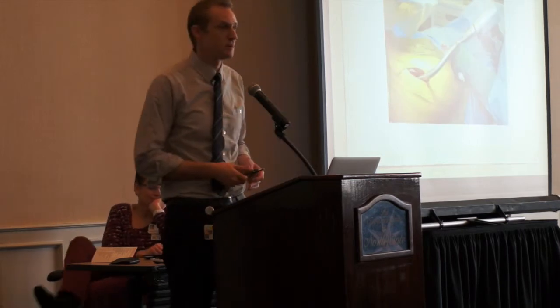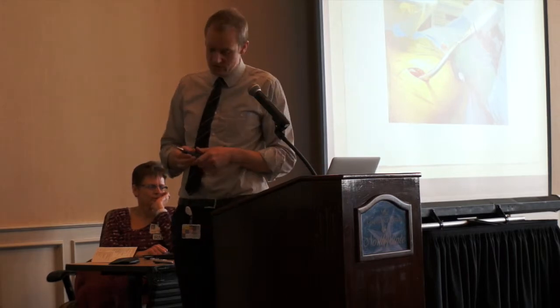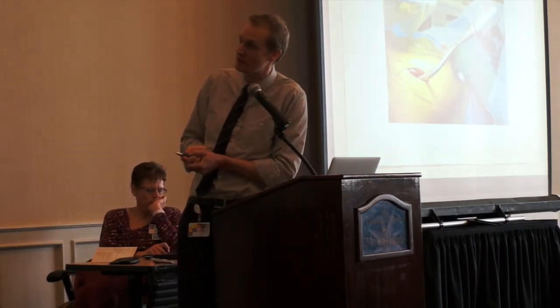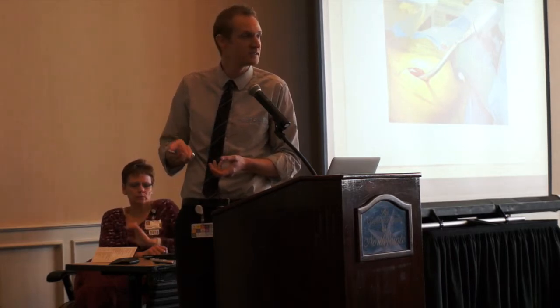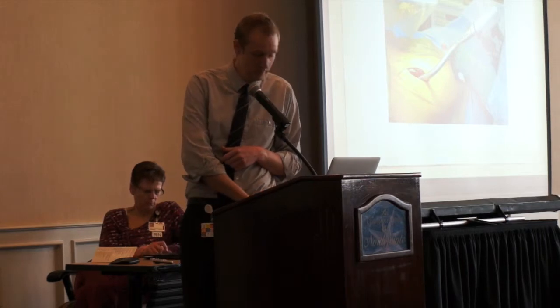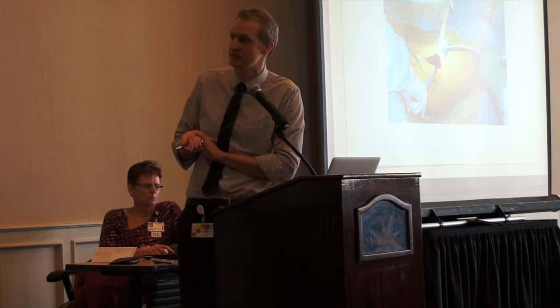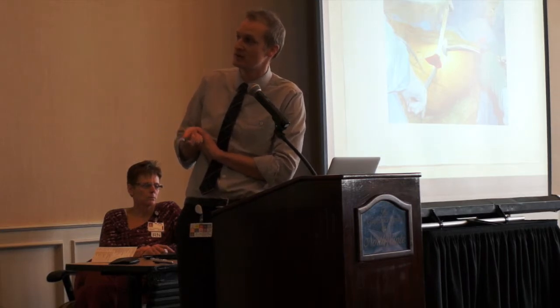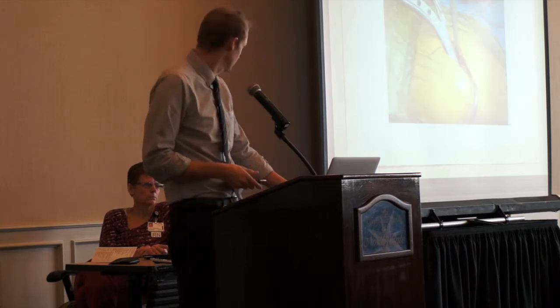So what we're looking at here is preparing the acetabulum. Through the small wound, we're using a reamer to prepare the acetabulum. What's important to notice here is the C-arm imaging device. Again, remember, it's all about being able to use X-ray and make sure that when you prepare the acetabulum, you're doing it in the exact position that you want. So here we are implanting the final device, and notice the C-arm is still there to make sure that it's placed in the appropriate spot.